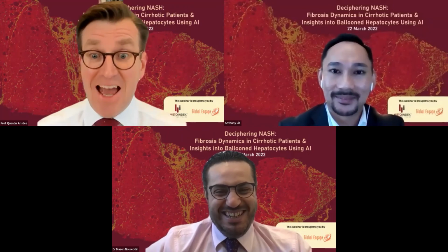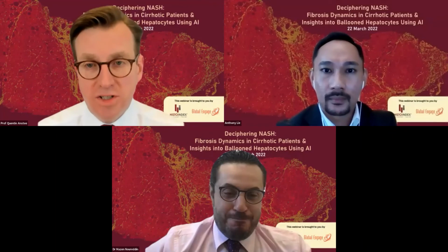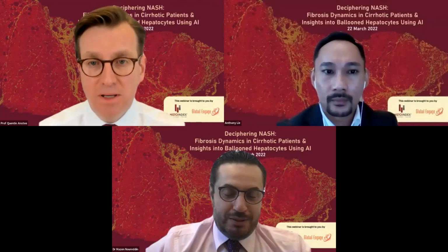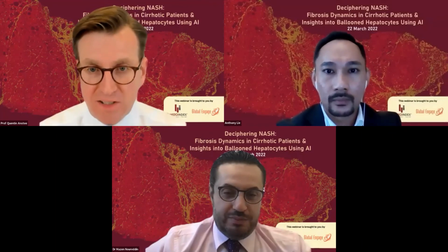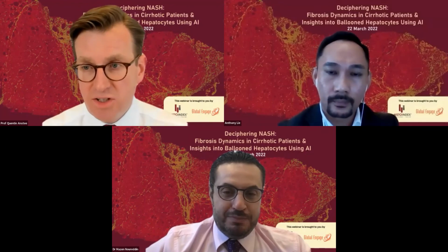Short answer, Quentin, would you go first? Yes, it's a very short answer. Yes. Indeed. I think we need to think about how that works. There are a number of different models. One is that one runs the algorithm, then presents the cells it considers ballooned to the pathologist, and the pathologist then, if you like, validates that response and uses it as an assisted thing.